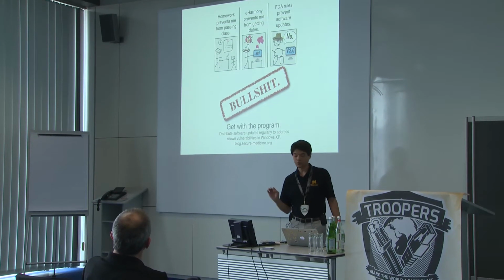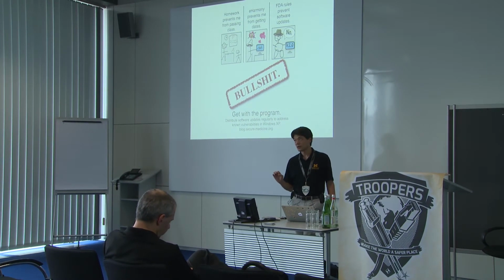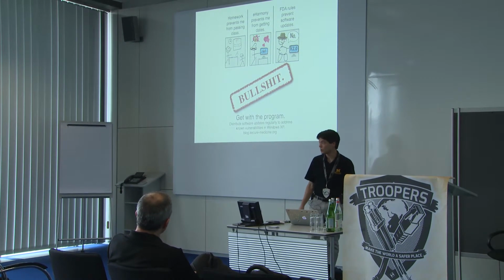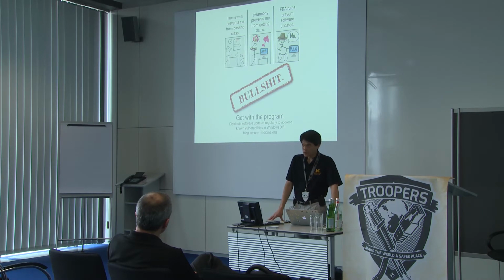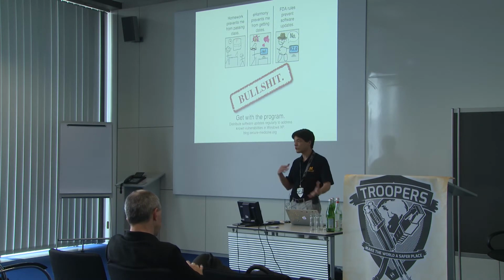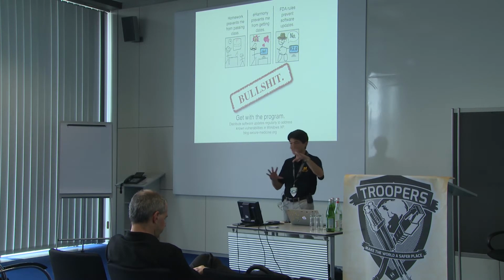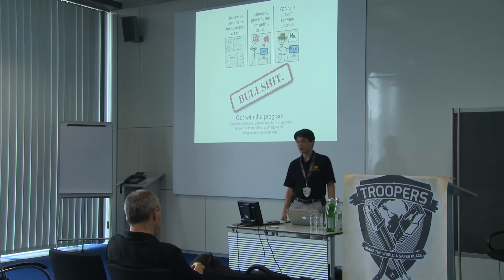The hard truth, however, is that there is a real cost to it. So keep in mind that updating a medical device is not as simple as downloading some new Linux package. There's some pretty sophisticated verification and testing that goes on. It takes a huge amount of engineering time. They need to validate that everything they produce matches their models. They have hazard analysis. They want to make sure that everything matches up as they expected. So it does take a significant amount of engineering time to do. However, the manufacturers do have an obligation to do this.